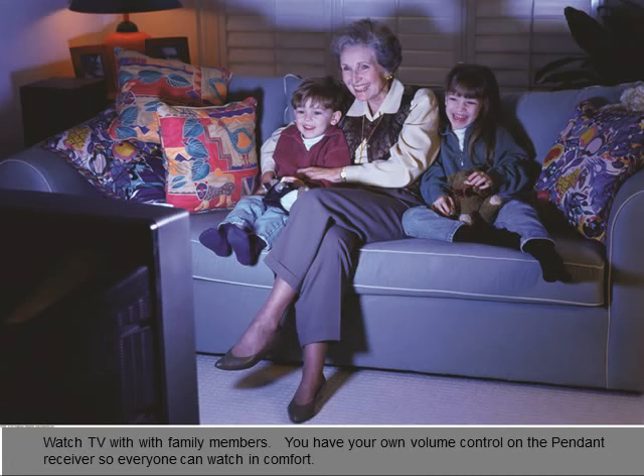Watch TV with family members — you have your own volume control on the pendant receiver so everyone can watch in comfort at their preferred level.